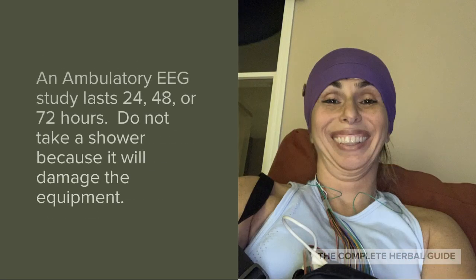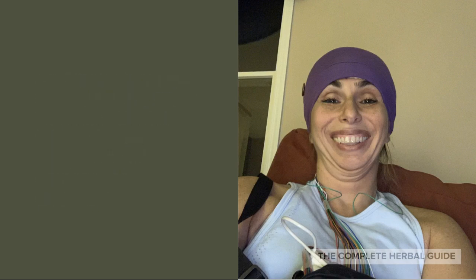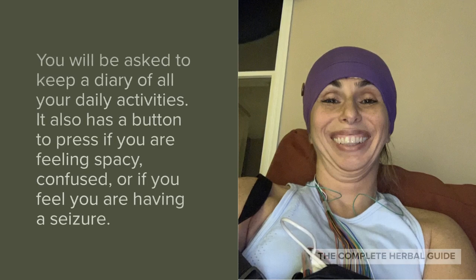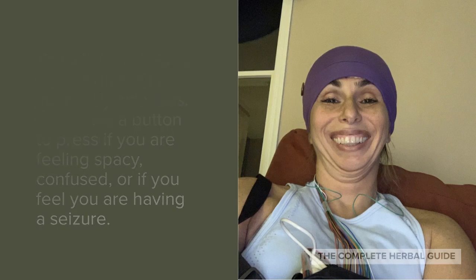An ambulatory EEG study lasts 24, 48, or 72 hours. Do not take a shower because it will damage the equipment. You will be asked to keep a diary of all your daily activities. It also has a button to press if you are feeling spacey, confused, or if you feel like you are having a seizure.